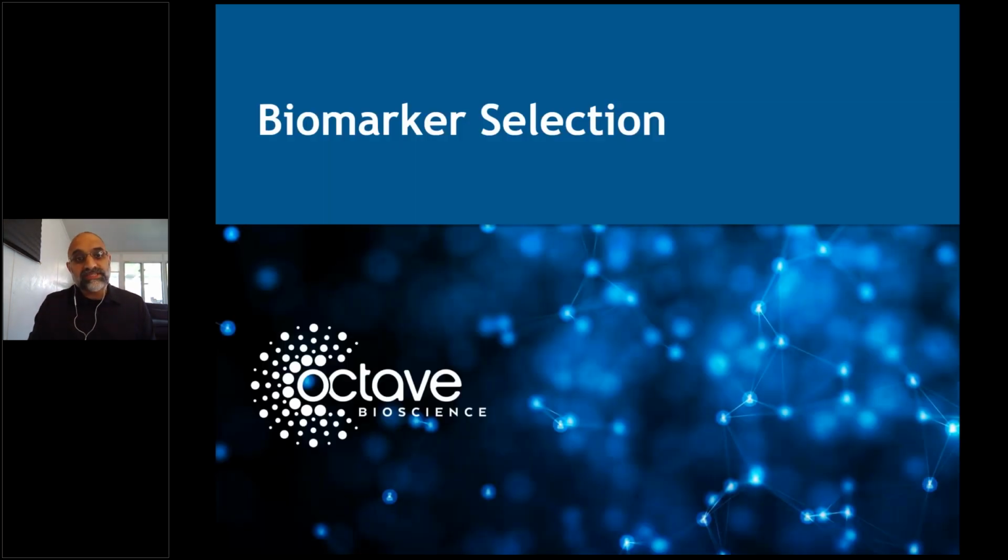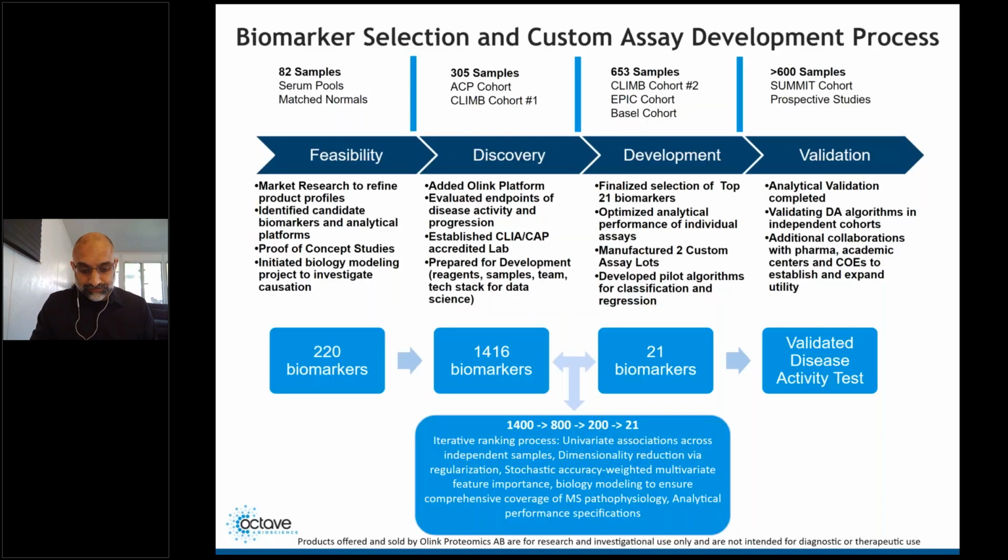A little bit on how we selected the biomarkers for our program. Our process to select biomarkers was staged into feasibility, discovery, development, and validation, which is the stage that we're currently in now. As we advanced through each stage, we were increasing the number of samples and the studies we had access to, which we used to hone in on the features that would be included on our custom panel. We were very fortunate to gain access via collaborations to several deeply phenotyped studies in which we had serum samples that had been collected alongside a rich set of associated clinical and radiographic features.